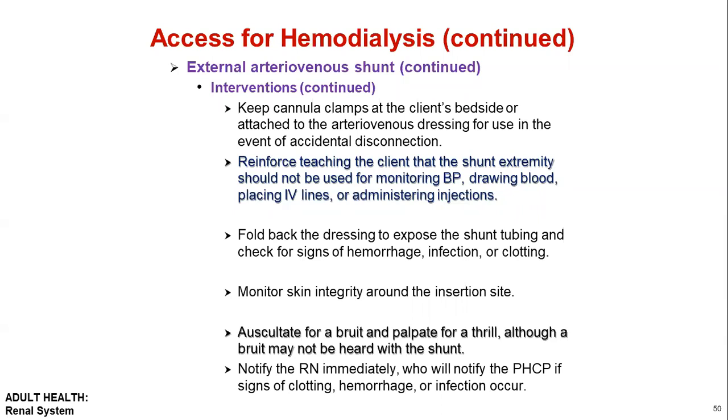Reinforce the teaching to the client that the shunt extremity should not be used for measuring blood pressure, collecting or drawing blood, IV cannulation, or administration of injections. Fold back the dressing to expose the shunt tubing. Monitor the skin integrity around the insertion site. Also auscultate for bruit and palpate for thrill.